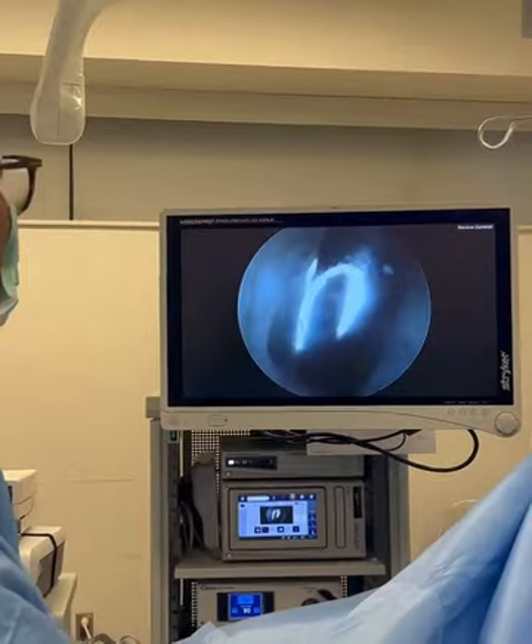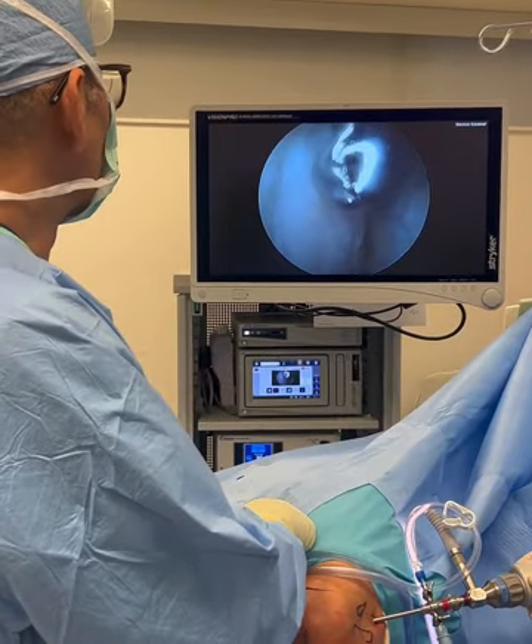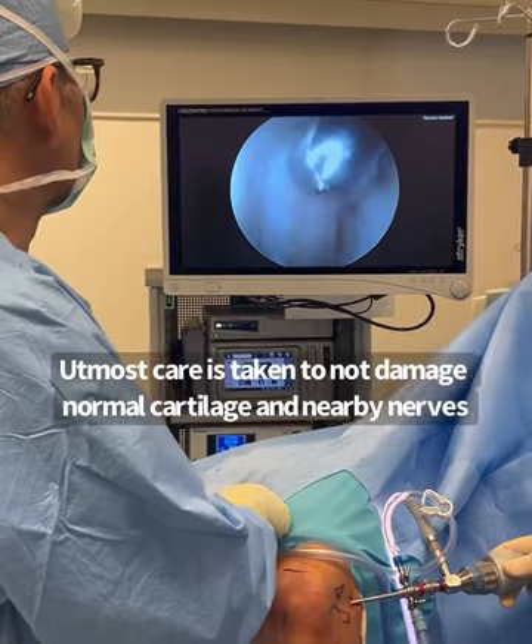The key during elbow arthroscopy is to be very careful using suction while using these types of motorized devices in the joint, because you don't want to suck in the vessels or the nerves that are very nearby.